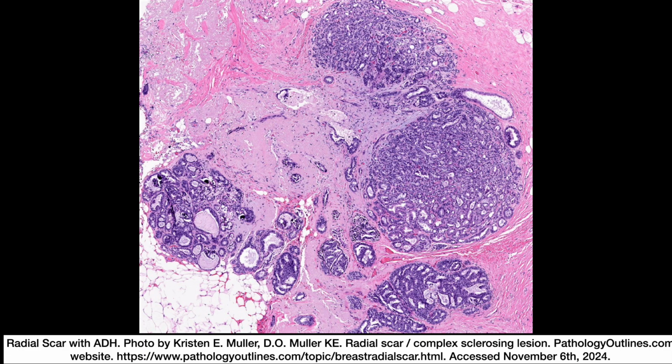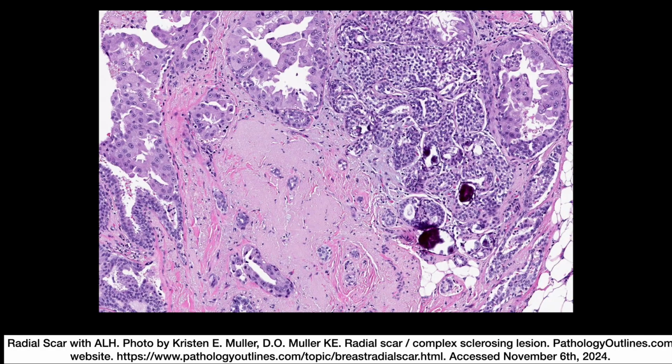This is an example of a radial scar with atypical ductal hyperplasia. So fibroelastic stroma again, some adenosis with some intraluminal calcifications, but here you see some slit-like architecture that has a pattern of cribriforming and with some monotony in the nuclei.